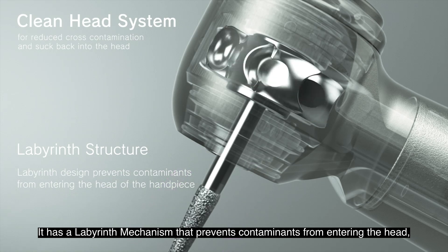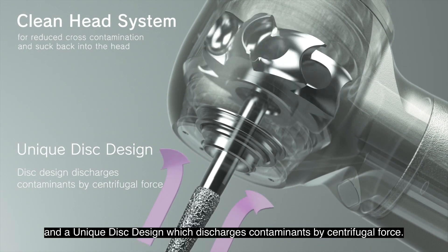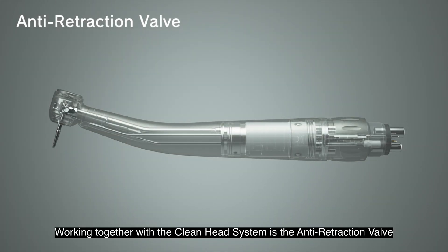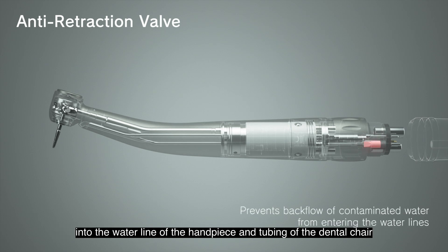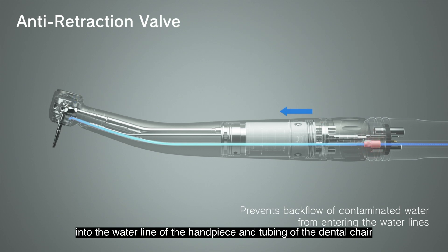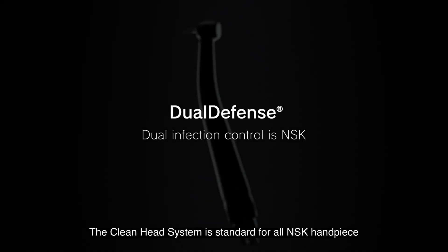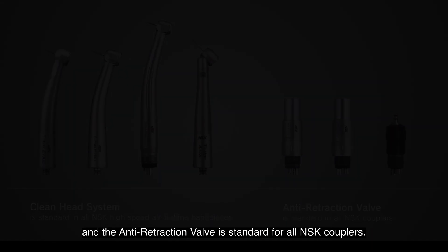It has a labyrinth mechanism that prevents contaminants from entering the head, and a unique disc design which discharges contaminants by centrifugal force. Working together with the clean head system is the anti-retraction valve, which prevents backflow of external objects into the waterline of the handpiece and tubing of the dental chair, minimizing the risk of contamination. The clean head system is standard for all NSK handpieces and the anti-retraction valve is standard for all NSK couplers.